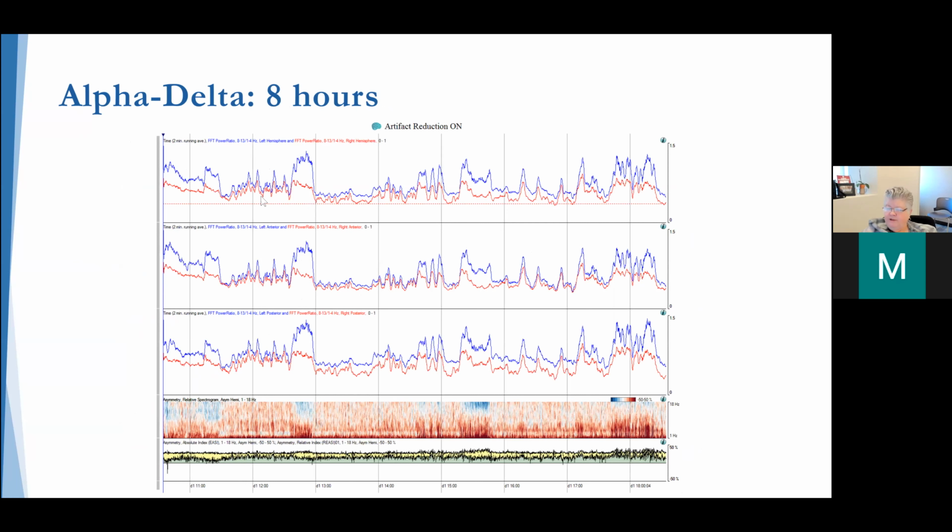clipping was performed. And what I want to point out here is this concept of variability. So we see that there's a difference between the left and the right hemisphere, suggesting ischemia on the right. But the main difference is this decrease in reactivity of the EEG. Here we see a nice increase in alpha activity as the patient is aroused over the left hemisphere, but that's very blunted over the right hemisphere. And so often the first change that we see on these alpha delta ratios is a difference in the alpha and delta at times when the patients are alerted.